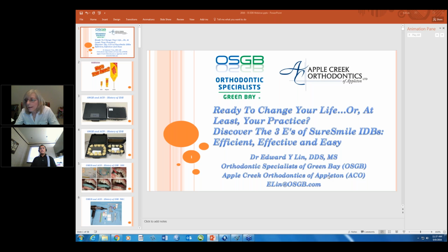The first question that's come in is, how successful is subgingival bracket placement? And at this point, do you direct bond those brackets, or do you include them in the IDB tray? If the software allows us to keep the bracket on a digital model for subgingival bracket placement, we keep it on there. Otherwise, the software basically gives you a red flag. It says you can't do it. So you basically just remove the bracket. It's just a little button, remove bracket, and it comes off. Then that tooth will have to be direct bonded.